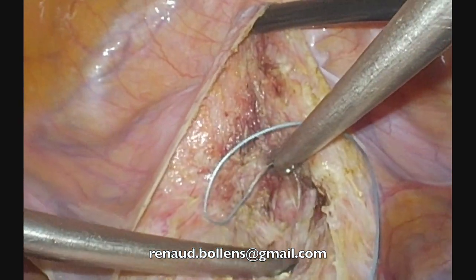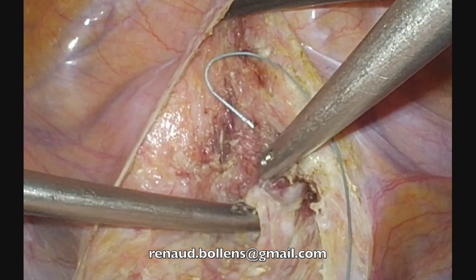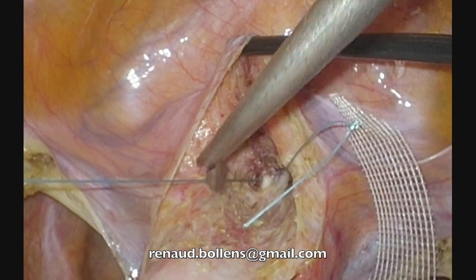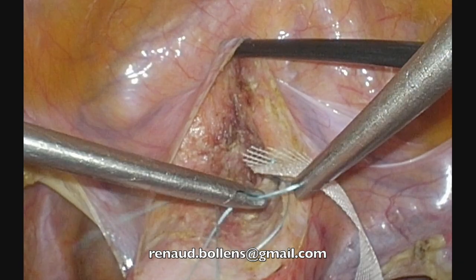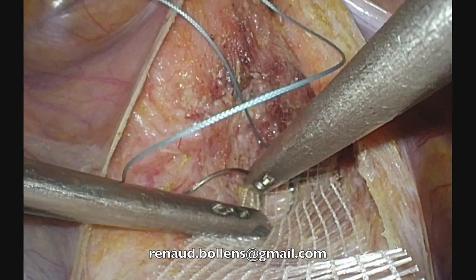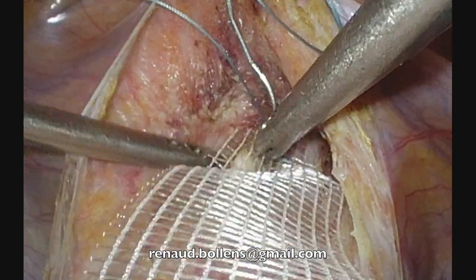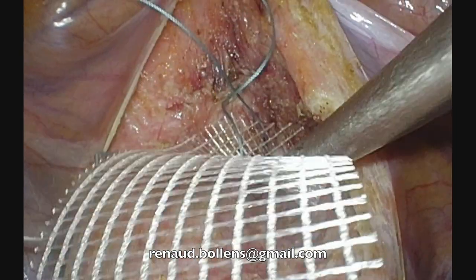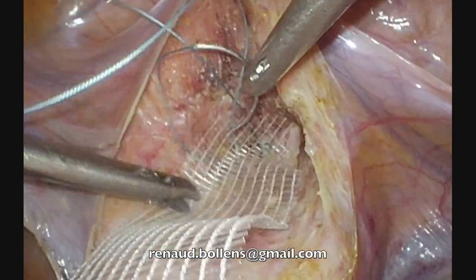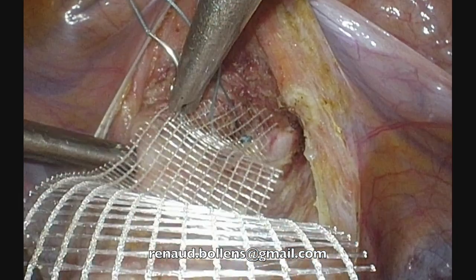I go down, and here you can try to use the curvature of the needle like that to pass in the vagina, but it's difficult to master. Then I will show you the best manner for me. I push on the vagina, I turn, and then with the other needle driver, I help the needle to come out. And like that, I take exactly the thickness of tissue that I want. If not, it's very difficult to take just the good part of the vagina. You can be too deep or you can be not deep enough.